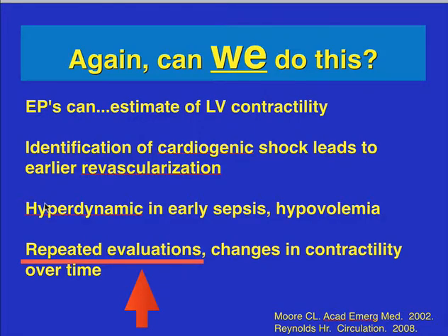If you order just an echocardiogram, you may get that done and you may get a read within a day. But then after you do your management plan, you're not able to reassess it quickly. Even if you order an official echocardiogram, you can do an echo at the bedside, make your management decisions that you may have made without your ultrasound, and then repeat your evaluation to see if the patient has benefited from your management plan, whether that was fluids, Lasix, pressors, or inotropic agents.